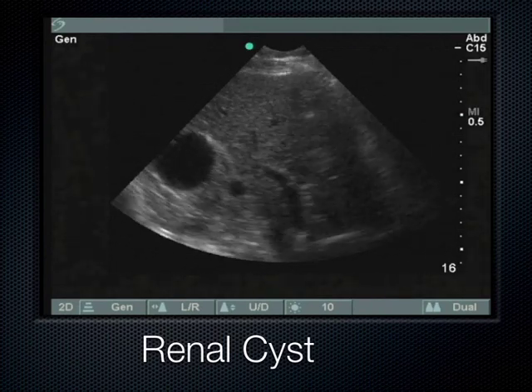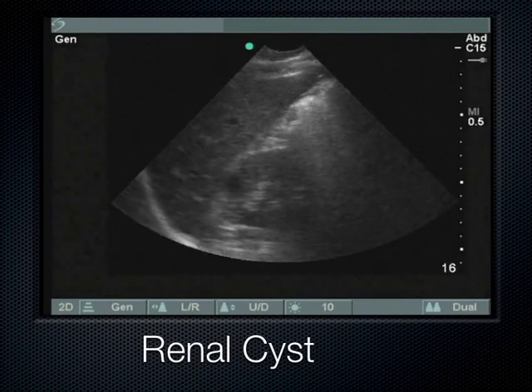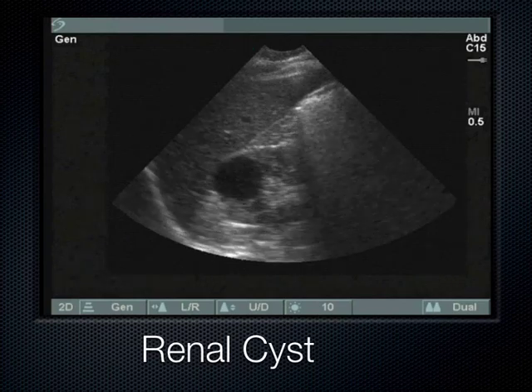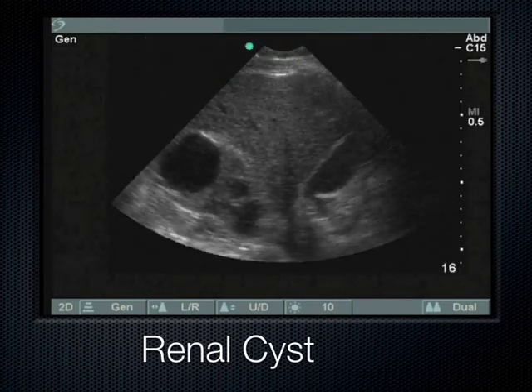But as we get out, we can actually see a cyst up here, and then there's another little cyst down here. Here's that cyst towards the upper pole over here. And no matter how you rotate the probe, from transverse to coronally, the cyst is always spherical and anechoic in all planes.